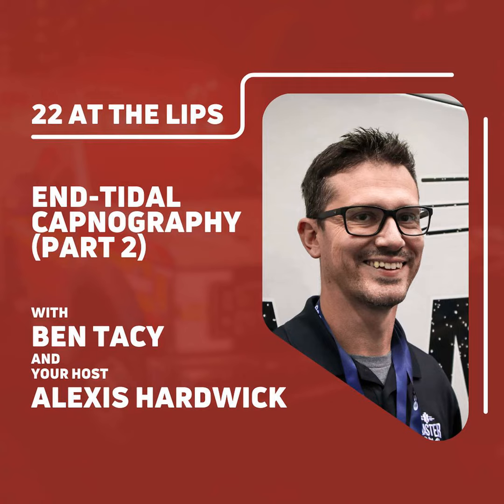Other ways of using capnography: CPAP is probably the most useful airway device that's on an ambulance. So connecting those, you can use the same cap that you put on the end of your ET tube or your advanced airway and put it in line. You can conjure it up and make it fit.